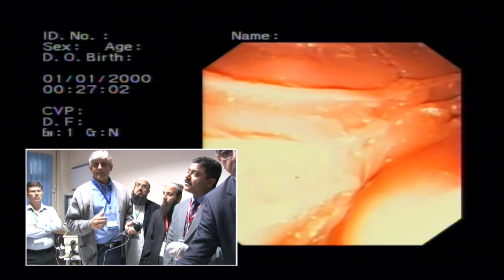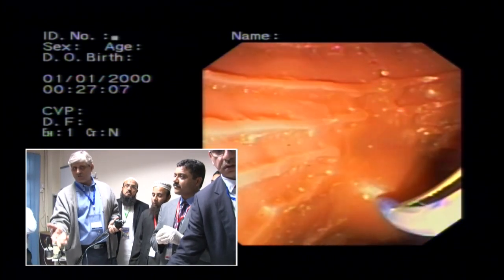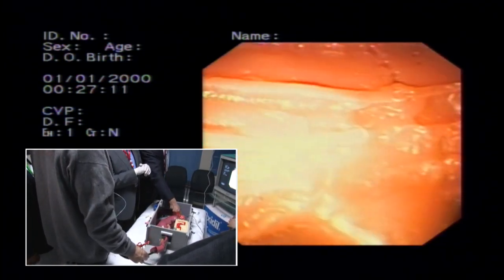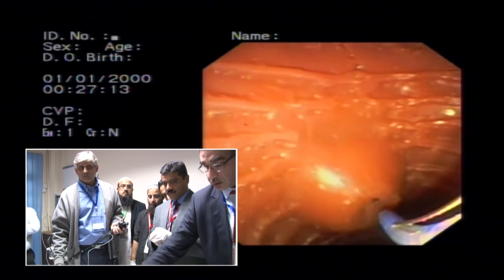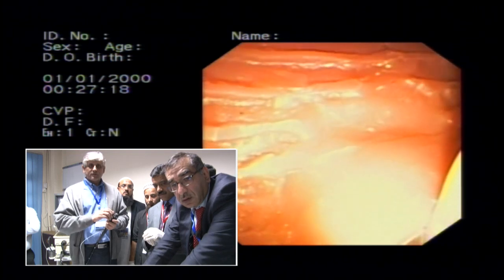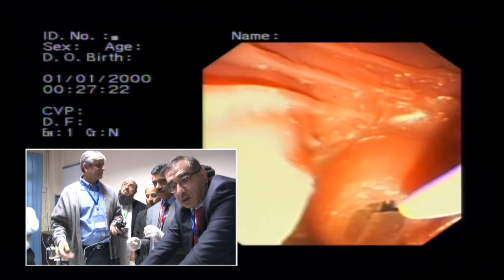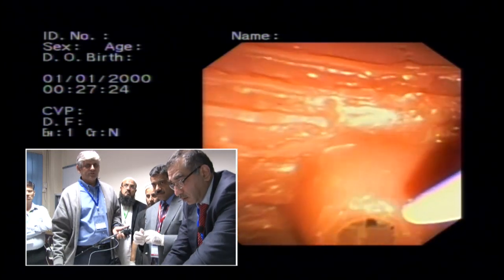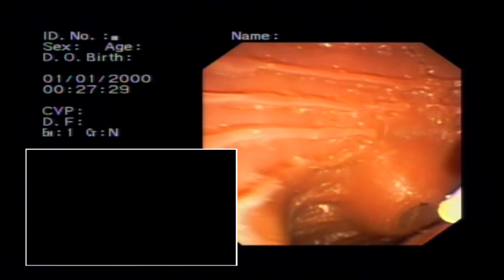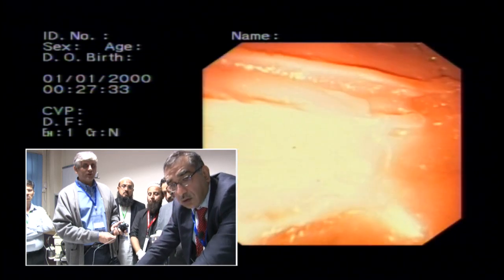He says wire is in. At the same time, I've got this position that I showed you. I am in that position. See, it's a little better now. You just take it a little up and left, a little bit out. Whatever method you use, I feel that it's better if you allow the ampulla to come close to you when you've got the tip, like this.